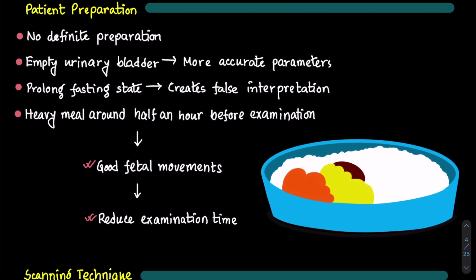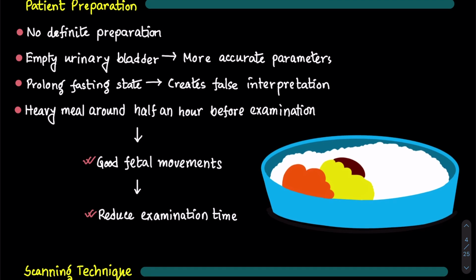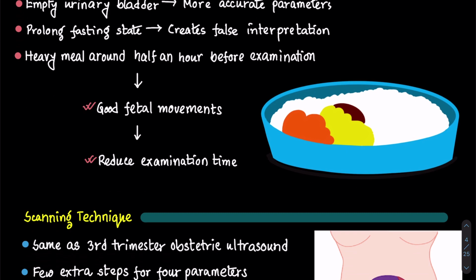Vibroacoustic stimulation, maternal movement, manual manipulation of the maternal abdomen, ingestion of orange juice help awaken or stimulate a non-reactive fetus. The acoustic stimulator is essentially an artificial larynx that generates mixed frequency sound at rather high intensities. It's like walking behind some unsuspecting person and buzzing him or her with a boom. This also can create fetal hyperactivity for many minutes. I would rather choose other ones.